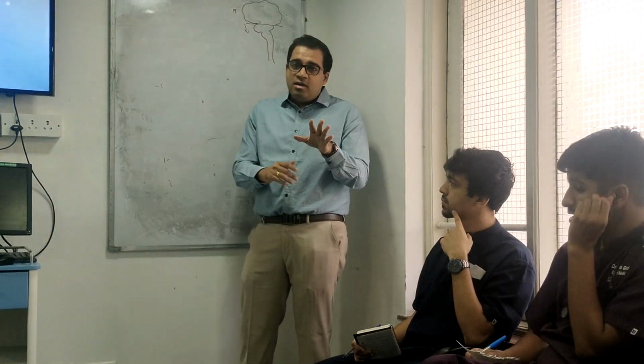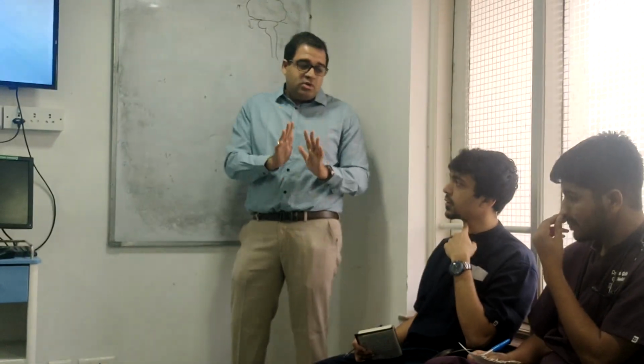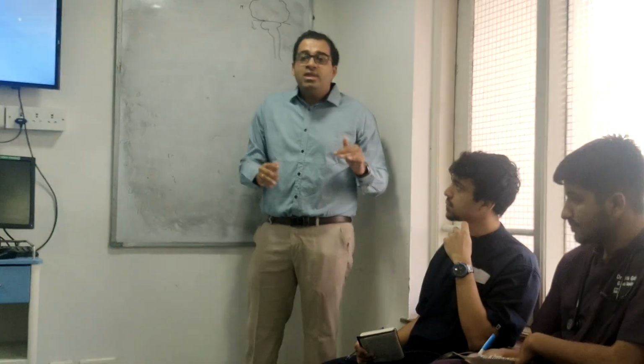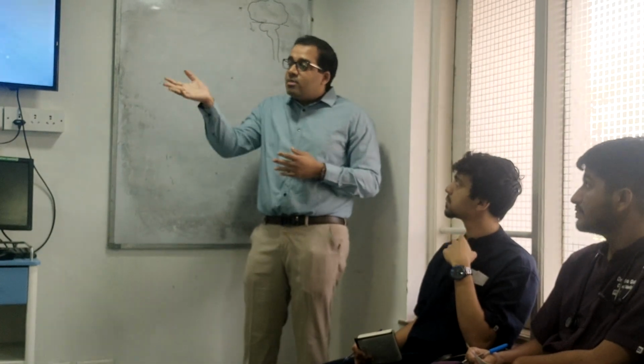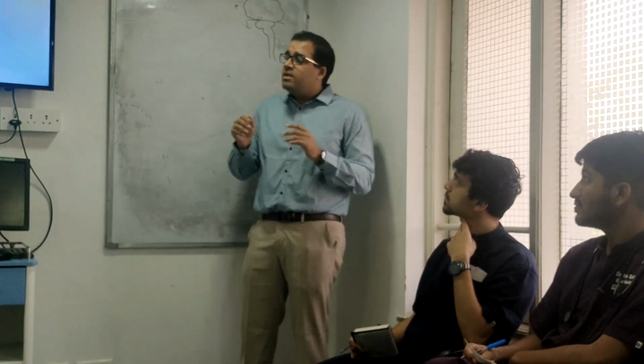They get identified, and the next day you will get a sensitivity because of a Vitek 2 system. It's all automated. Okay, automated के भी limitations हैं. For example, many a time you will find colistin MIC बहुत high है, colistin resistant आ गया. It is very inferior for specialized drugs like colistin, where you have to use other methods.